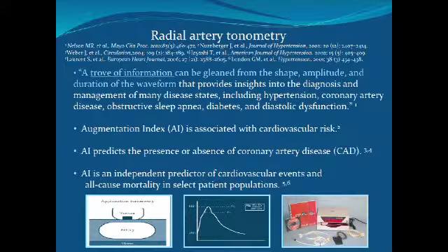In our results, in our little cohort of diabetic children, they had increased arterial stiffness even at this young age. It was very dramatically different than the other children who did not have diabetes. So what is radial tonometry? If you Google it or PubMed search it, you'll see hundreds of articles where people use radial tonometry to look at vascular health.